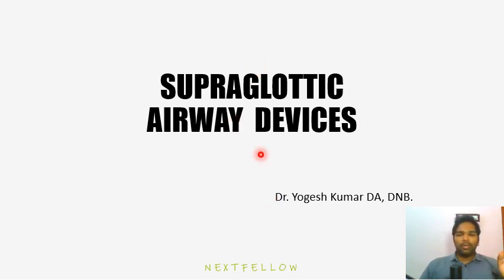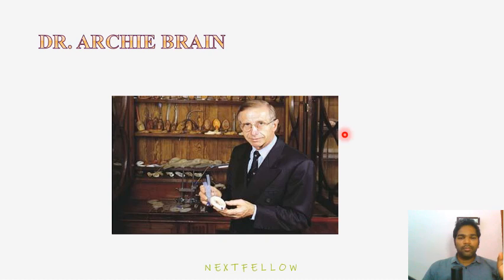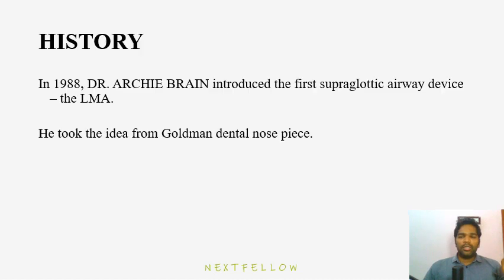I will show you how it is inserted in the next slide. So this is Dr. Archie Brain. He is the brain behind this LMA. He was the person who invented the laryngeal mask airway, and he took the idea from a Goldman's dental nose piece.